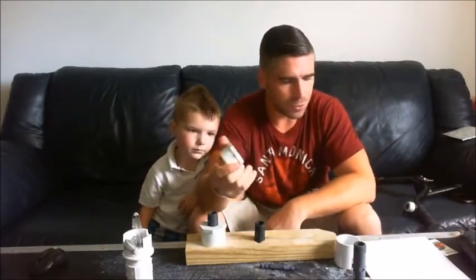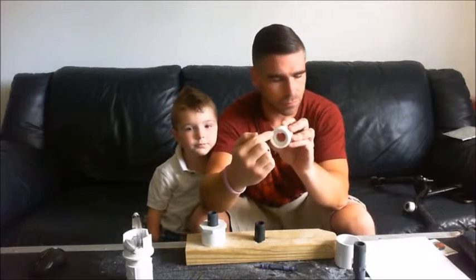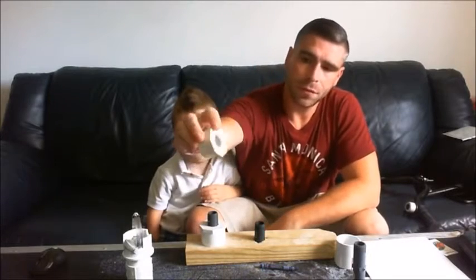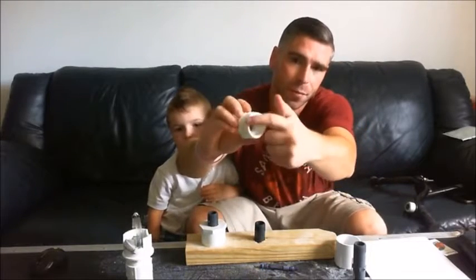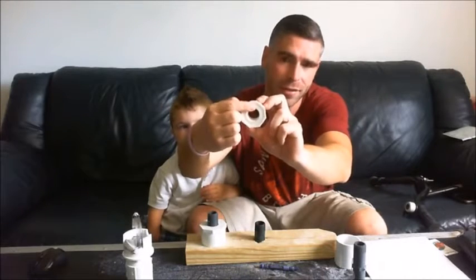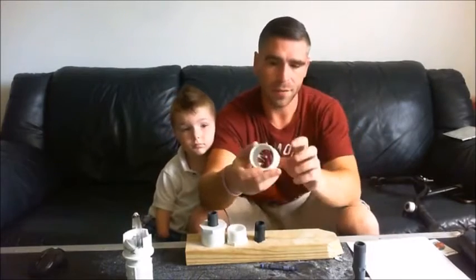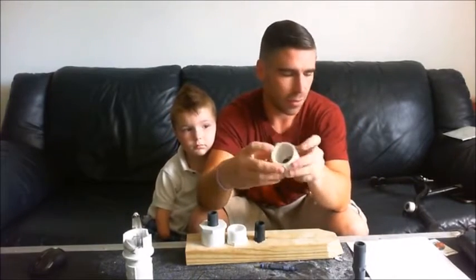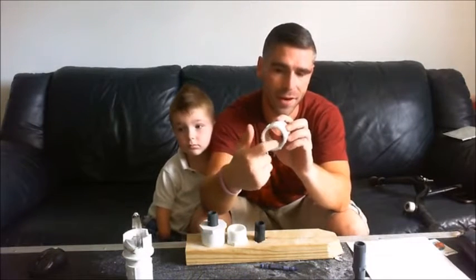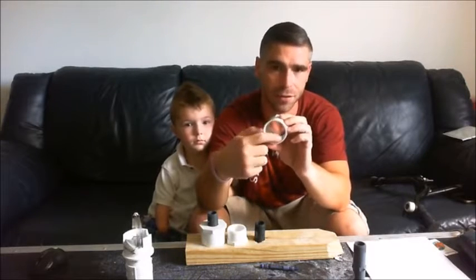From there, we're going to go to a 1 and a half inch to 3 quarter inch threaded bushing reducer — 1 and a half inch threaded on the outside and 3 quarter inch threaded on the inside. And then for the final piece of PVC, we have a 2 inch by 1 and a half inch threaded PVC coupler. The inside 1 and a half inch side is threaded; on the 2 inch side there are no threads.